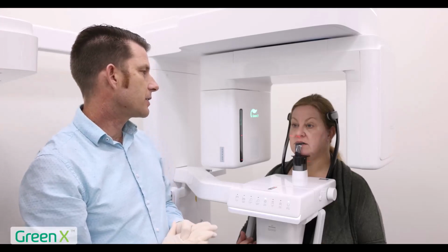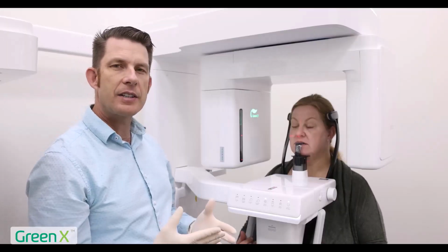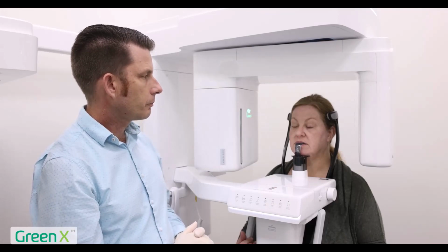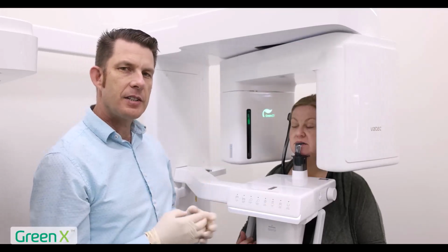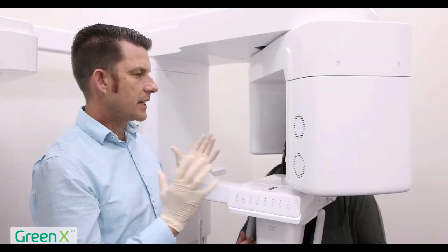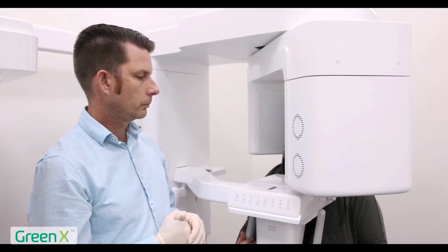I'm going to have the patient just go ahead and close your eyes, relax, and with CBCT capture, the patient can just relax their tongue. So I'm going to click on the Ready Return button. The system is moving into image capturing position. Please wait. When capturing your CBCT, it's very important to make sure that the patient does not move and remains as still as possible. Once this gets into position for capture, it will also tell the patient to close their eyes. The system is ready to capture an image.